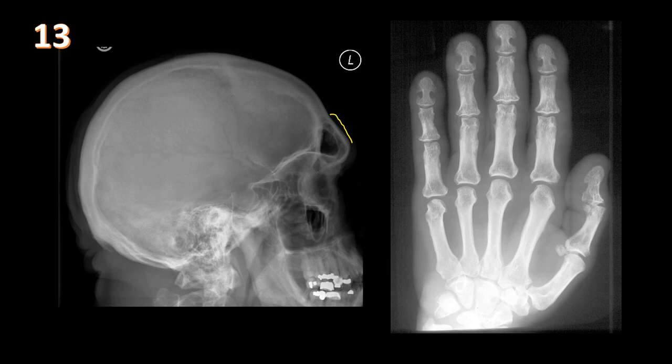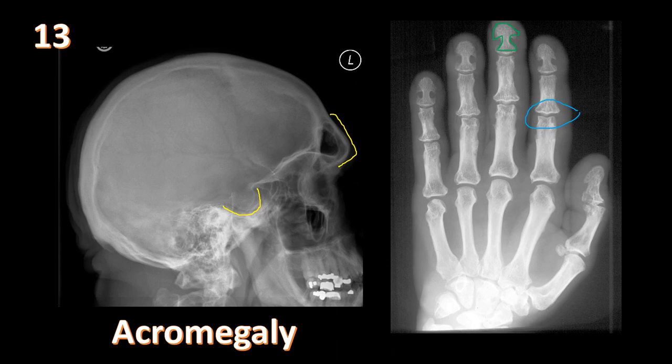Lateral view of the skull and PA view of the hand show frontal bossing, hyperaeration of the frontal sinus, and an enlarged sella — likely from a pituitary macroadenoma. The hand shows classic spade-shaped distal phalangeal configuration and widened articulations from cartilage thickening. This is acromegaly, likely related to a pituitary macroadenoma secreting growth hormone. Additional findings include thickening of the heel fat pad.